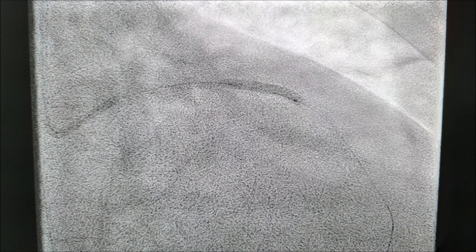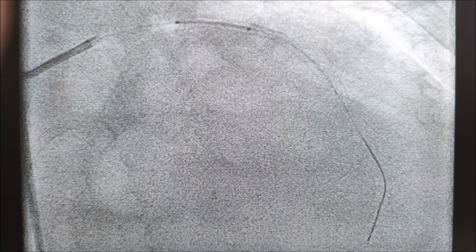Rewiring of the vessel was no problem due to the soft thrombus present. We immediately tried to reopen and regain flow in this vessel by dilating, performing thrombus aspiration with the export catheter, administering tirofiban, and even attempted to stent the first part in a bail-out situation.